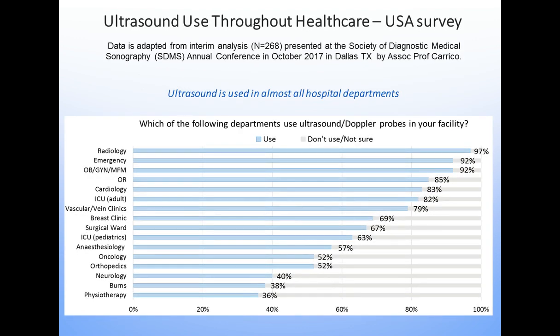One of the questions we asked people is where in the hospital is ultrasound used? And you can see there's a cross-section of a number of different departments here. You can see that in fact, all of these departments have reported some ultrasound use, depending on the specific respondent. But I think this just highlights how broadly ultrasound has proliferated to these departments. And I think from an infection control perspective, many infection preventionists would not be fully aware of the spectrum of ultrasound use across facilities.